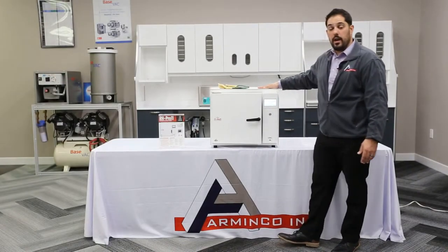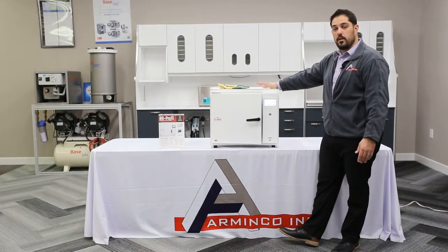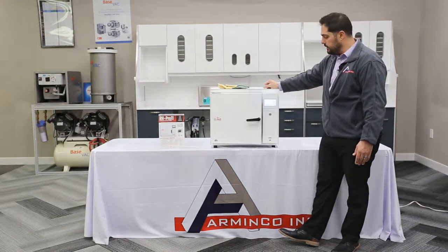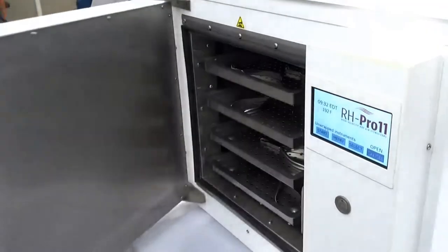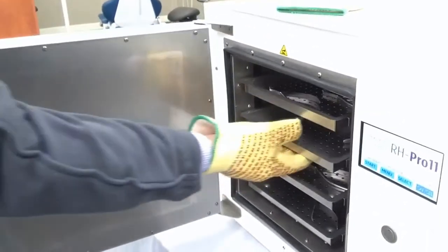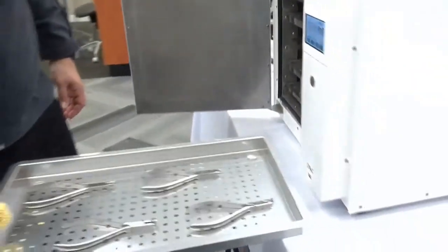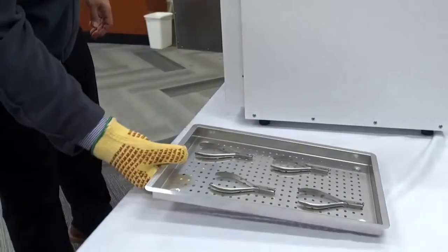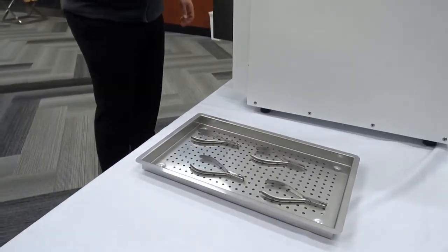Gone are the days of having to wait an hour and a half to two hours for your instruments and hand pieces to sterilize. The unit measures 22 and a half by 22 and a half by 18 and a half inches deep, and this is going to fit on any shelf where you currently have an autoclave or any other storage unit.